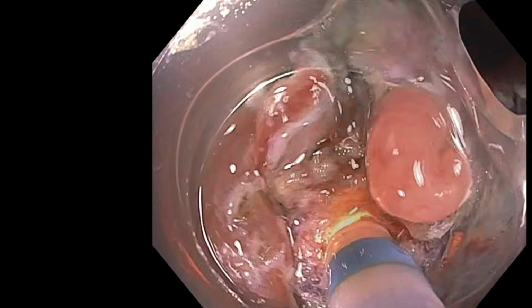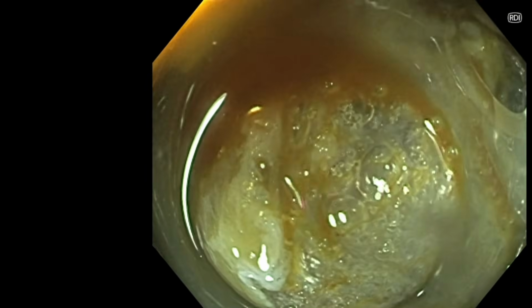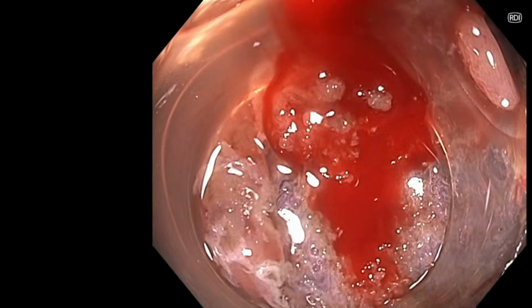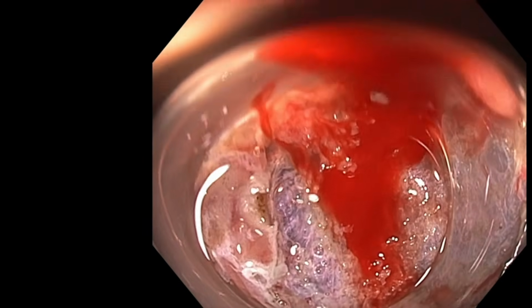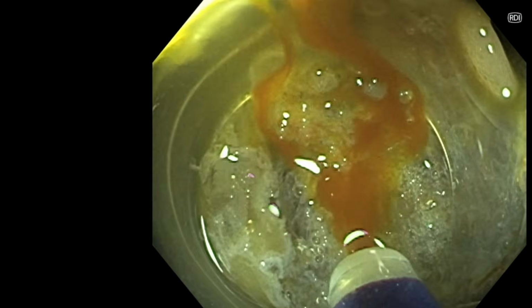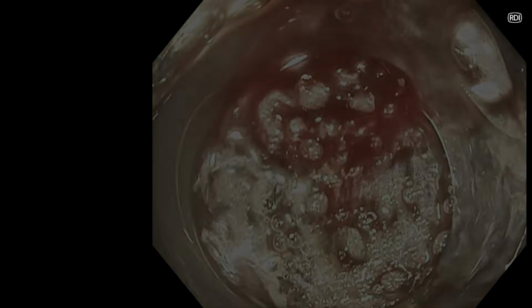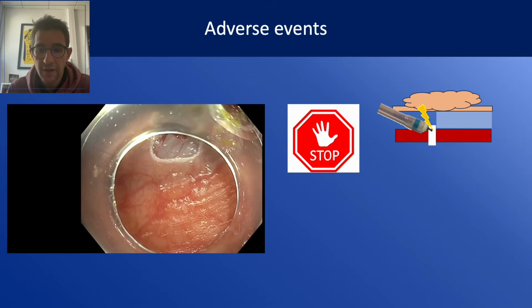You should be prepared to manage the adverse events like bleeding during the procedure. And for me, at least, RDI is a very good way to reduce the stress because when it's not red, it's not so stressful for me at least, and it makes it more precise in randomized trial to control the bleeding. So it's a good way.